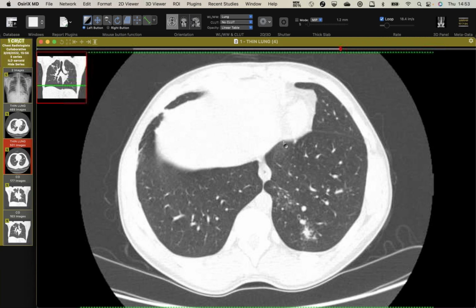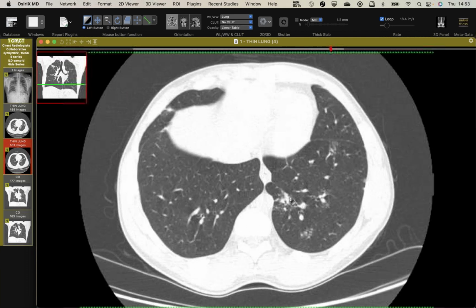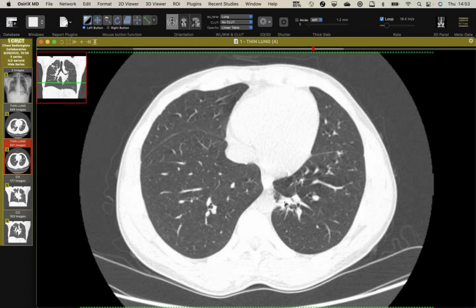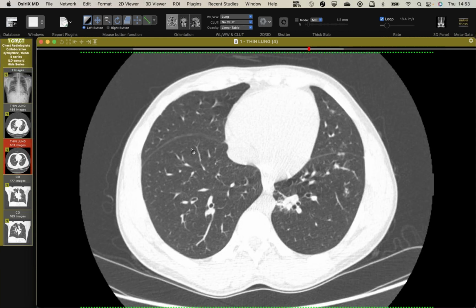It's just conglomerate granulomas, but it's interesting that when it's treated, it looks more like just the galaxy sign. So maybe it's a spectrum, and this guy presented with very advanced late disease. Interesting. He was from somewhere in sub-Saharan Africa. So it occurs all over the world. But not TB in this case.